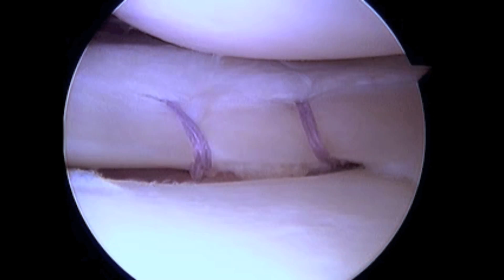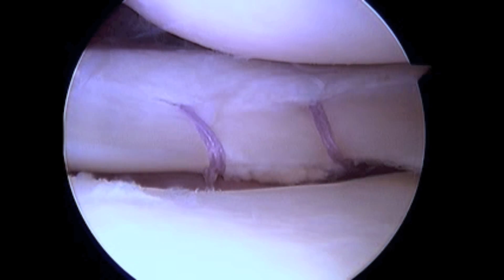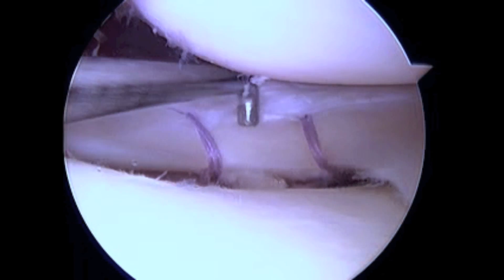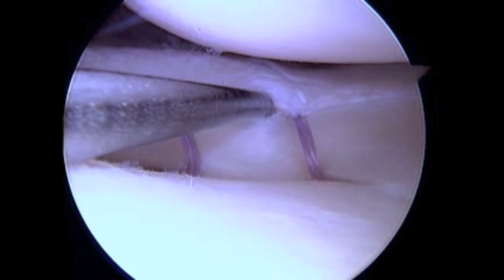Finally, after the repair is complete, we use a probe to test the security of the repair. We place the probe between the two meniscal fragments and again attempt to move the inner fragment into the joint space. The repair is found to be very secure without any instability whatsoever.